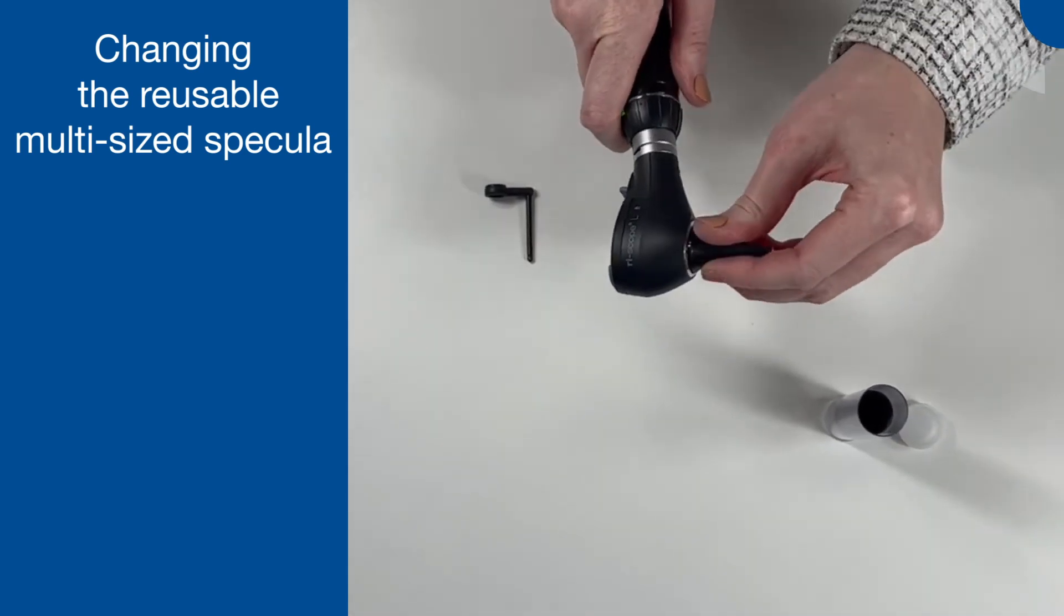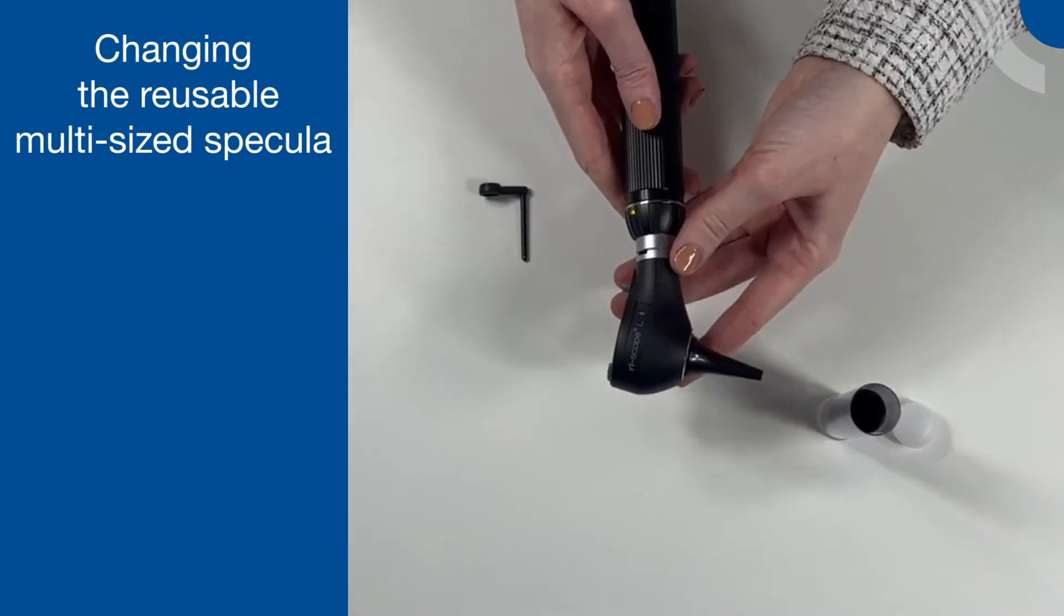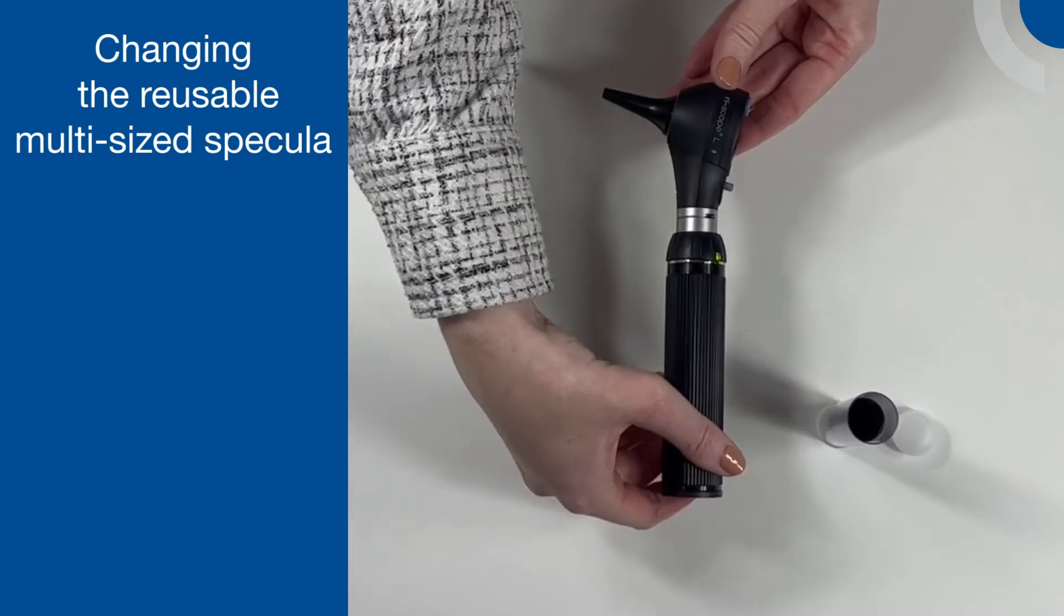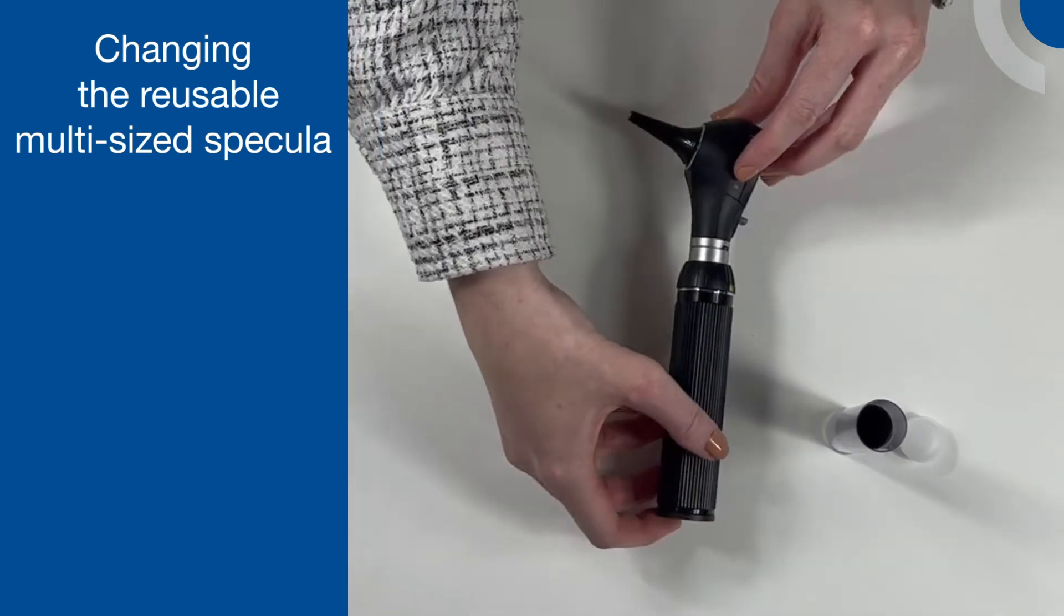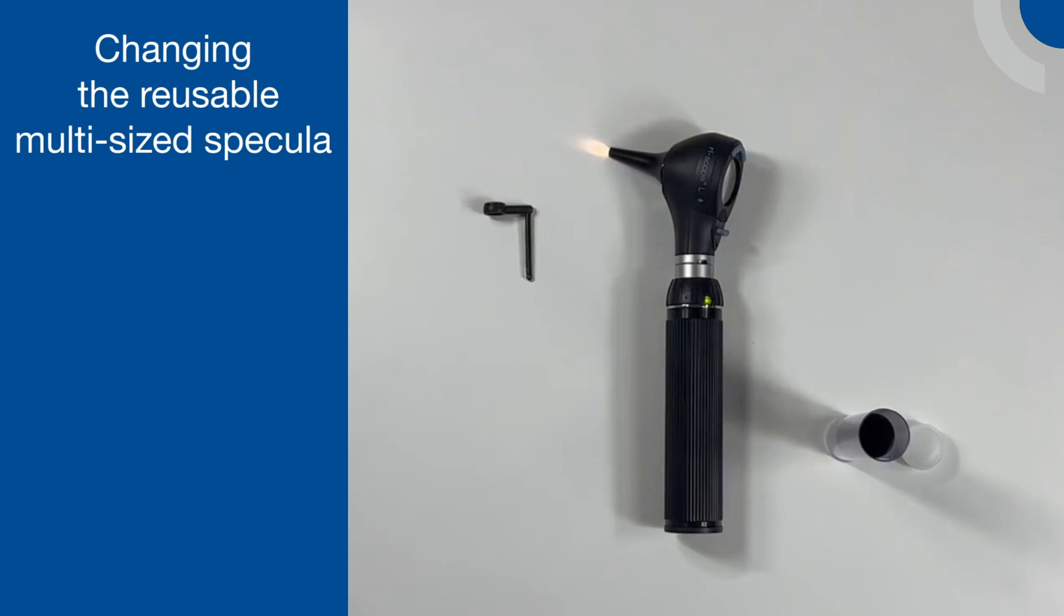To attach a specular to the otoscope, firmly press the specular onto the specular fitting. It is the silver ring integrated into the face of the otoscope and you can twist slightly to ensure it is engaged.